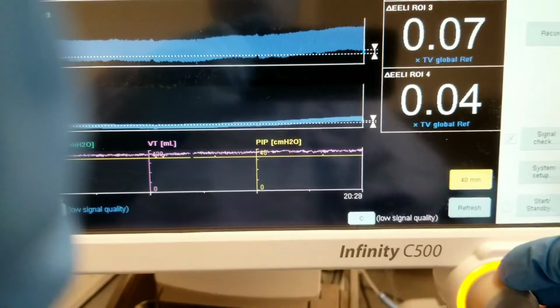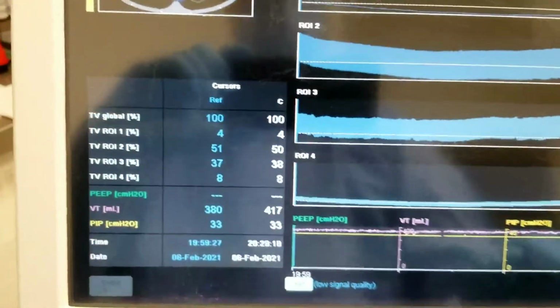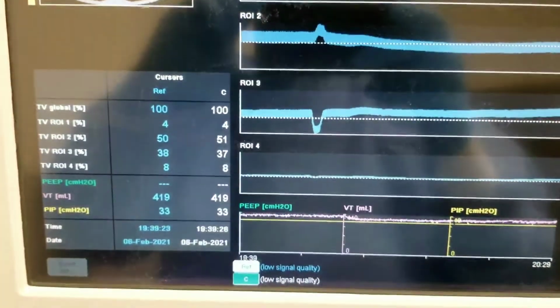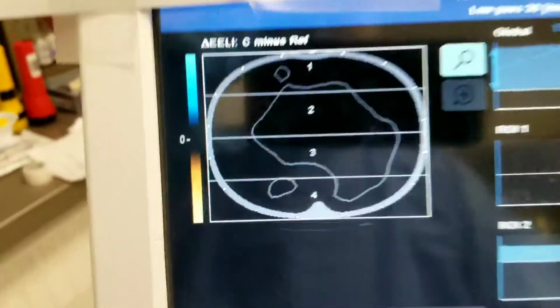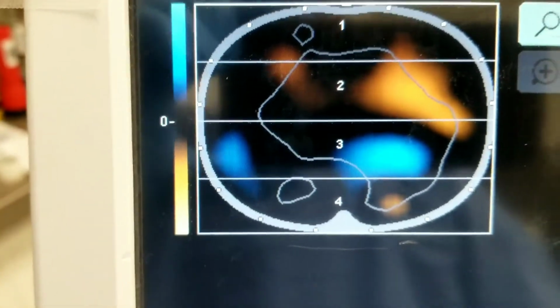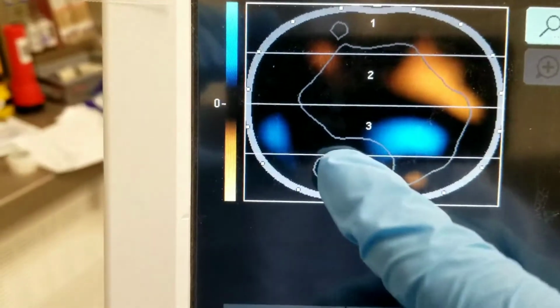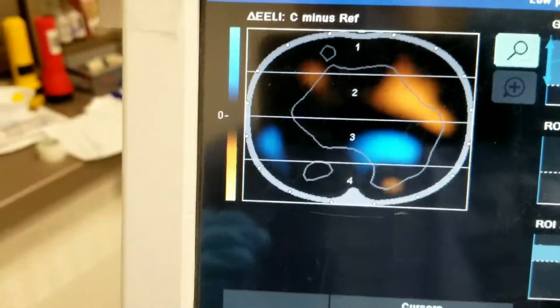Okay, I'm just curious. Let's do 50. All right, so let's kind of look at what's going on here as I move stuff over. Go a little faster. So losing in 2, gaining a lot in 3. Excellent. Gaining, oh, wow, losing a lot up here and gaining more here. That's wonderful. Now we did this by reducing, okay?